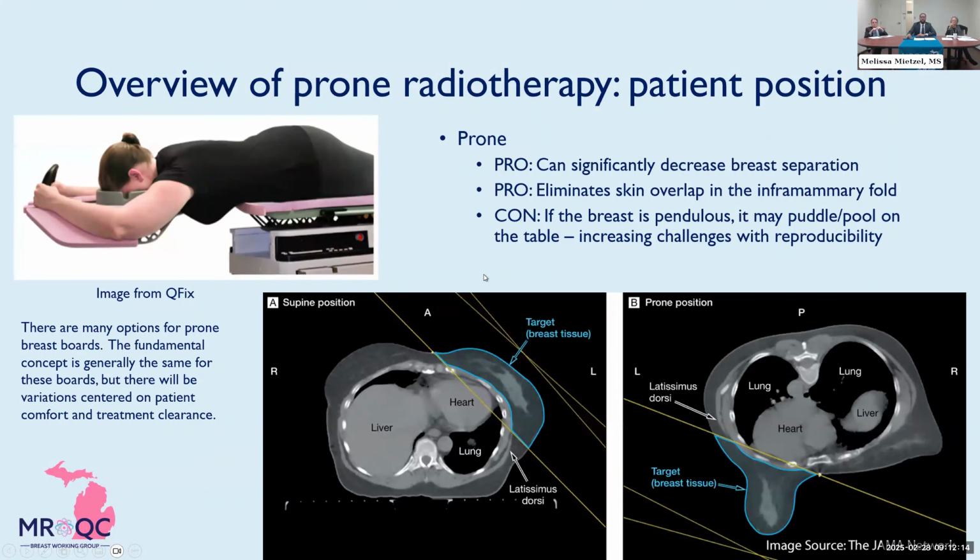Prone position is another option when it comes to modifying the patient's treatment position. And there are many options for prone breast boards. The fundamental concept is generally the same across all the available options. The differences between the different options will come in the form of patient comfort and treatment clearance. But the idea is that the patient lays prone with the treated breast laying in an opening that makes it accessible for treatment.